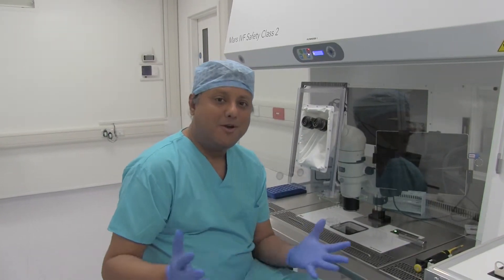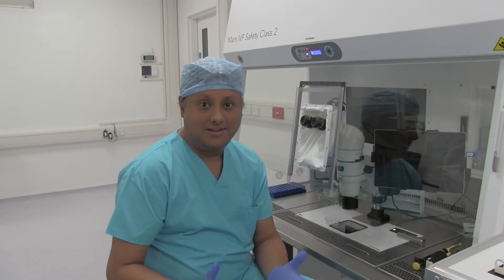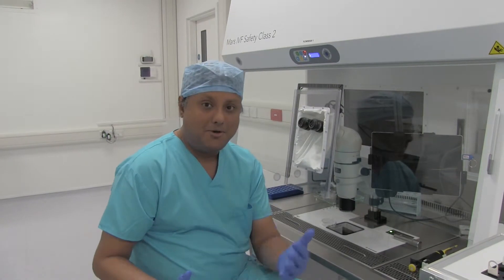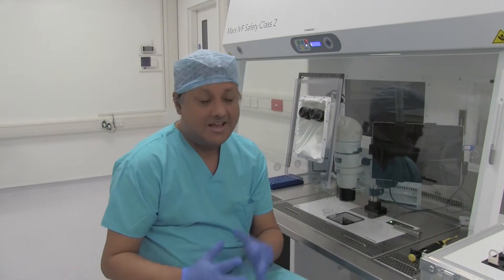Hi there, so now we're going to be doing a mock-up on what happens on a day of egg collection in the laboratory. So from an embryologist's perspective, the patient has to be witnessed.